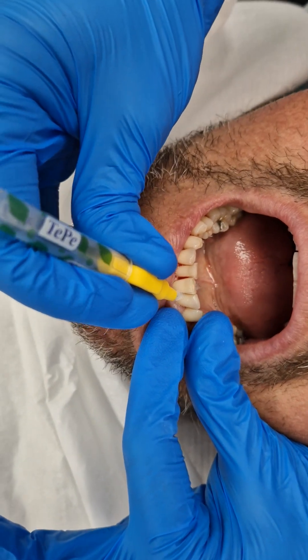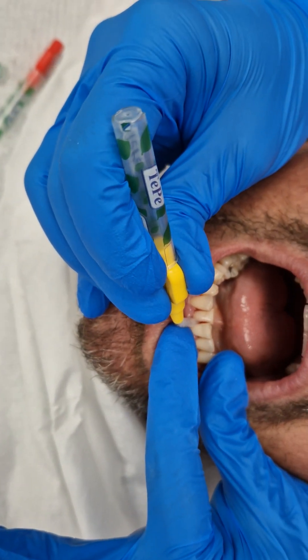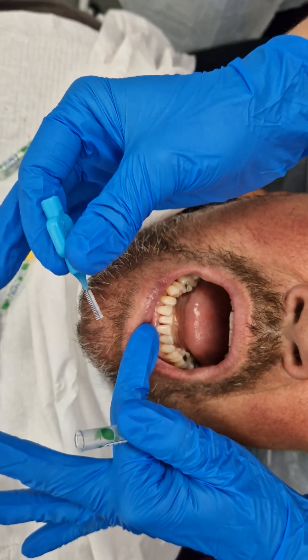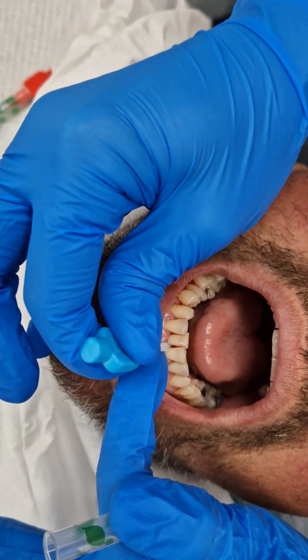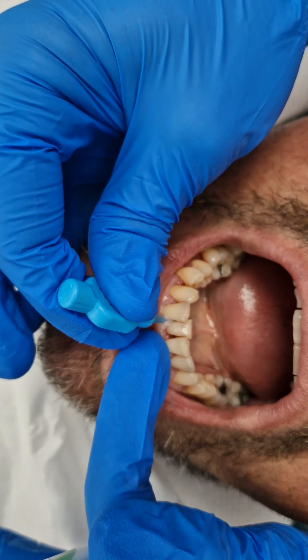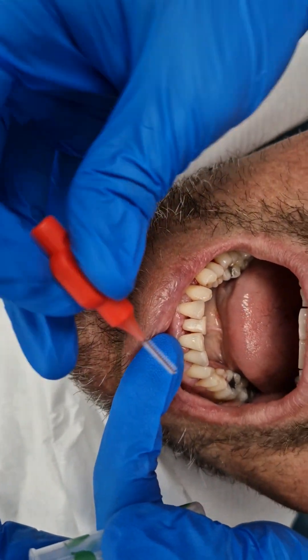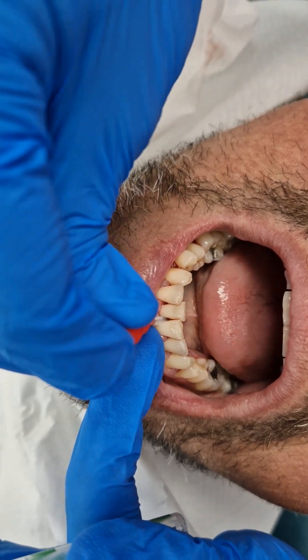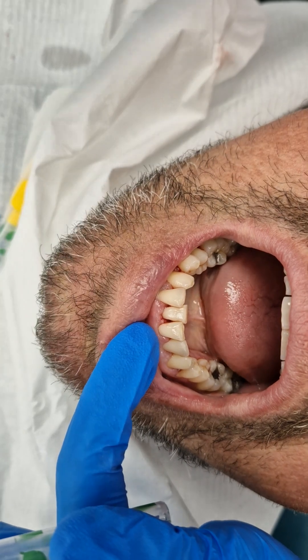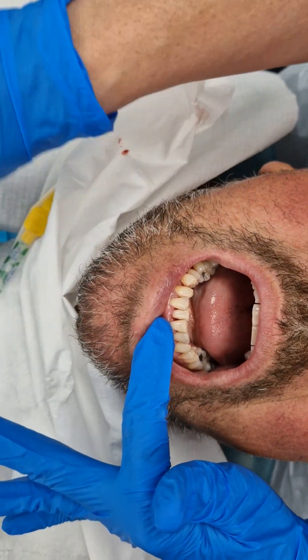It's got to feel quite snug as you go in and out, about five times, then find the next gap. If it's too tight and doesn't go in, don't force it — you want the next colour down, which is blue. You'll have different size spaces and your hygienist should size this up for you. Blue goes in this one; it didn't go in that one, so the next size down is red. Don't worry about the bleeding — the bacteria is causing the inflammation, so the more you clean, the less they will bleed.